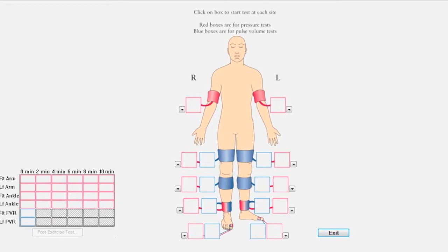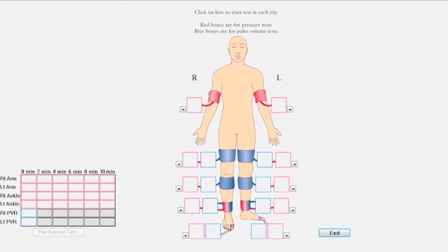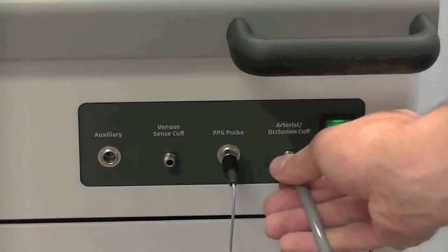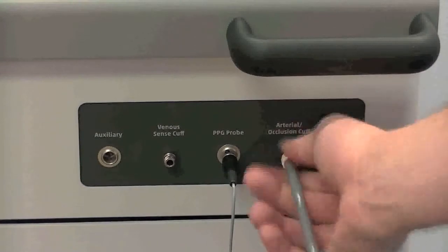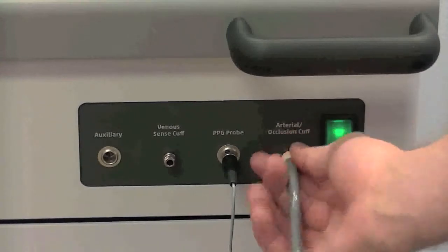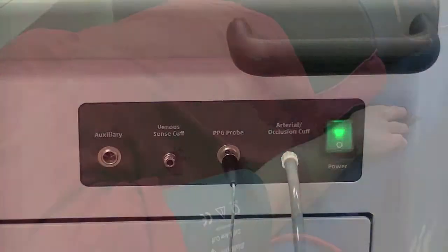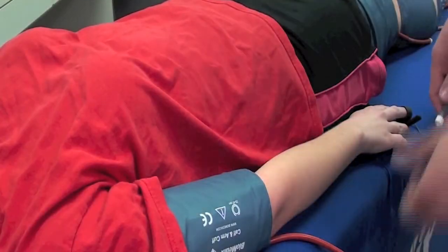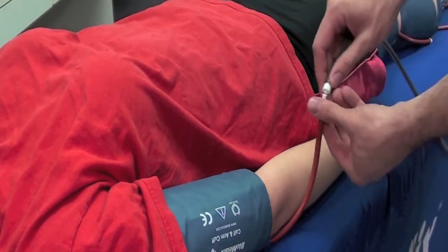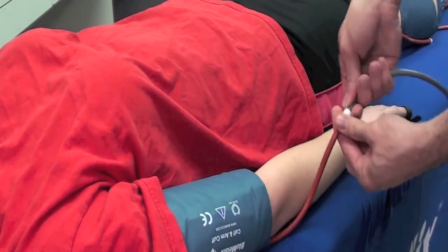The first location is the right arm. Click inside the right brachial red box on the test screen to begin testing. Connect the hose to the arterial occlusion cuff port on the front of the device, then connect the other end of the hose to the right arm cuff.